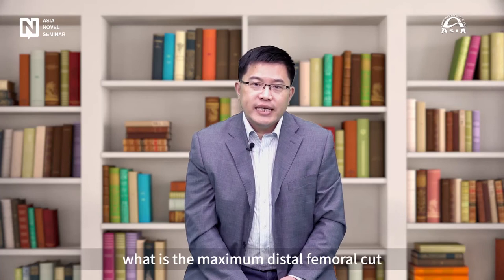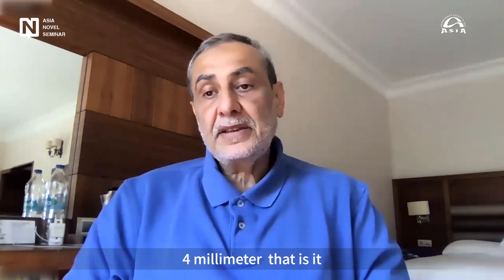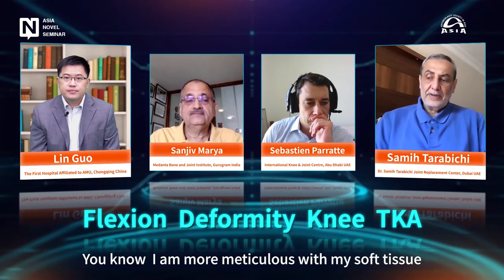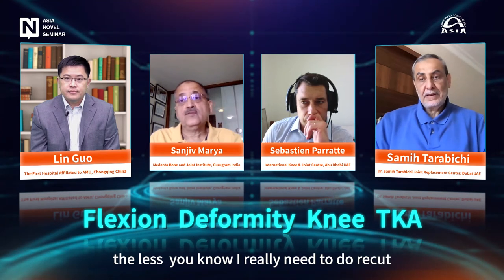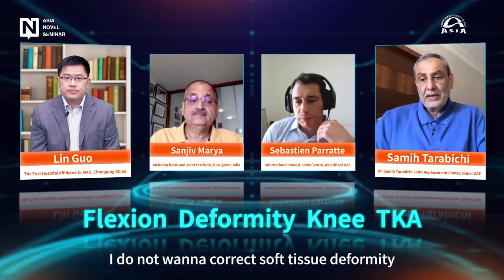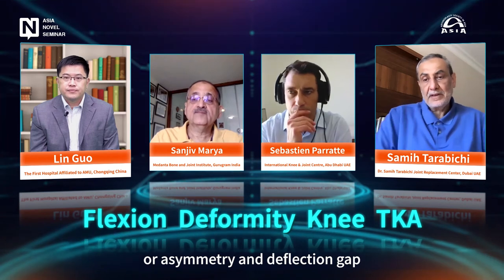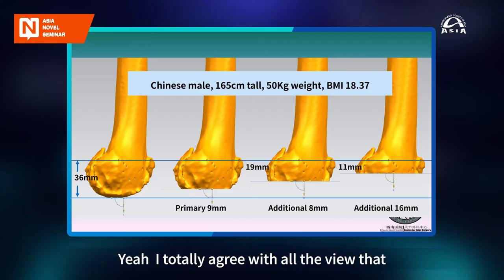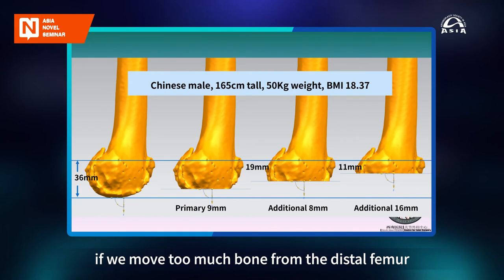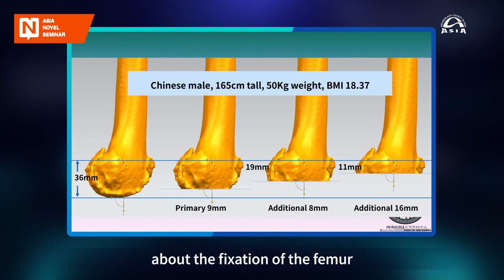Dr. Tarabichi, what is the maximum distal femur cut you would accept if you want to correct a flexion deformity? 4 millimeters, that's it. The more meticulous I am with my soft tissue, the less I really need to recut, because I don't want to correct a soft tissue deformity by creating another bony deformity or asymmetry in the flexion gap. So the maximum is 4, and I think it has been a long time since I've done 4. Yes, I totally agree that if we remove too much bone from the distal femur, we have the problem of lifting the joint line, and we also have a problem with the fixation of the femur.